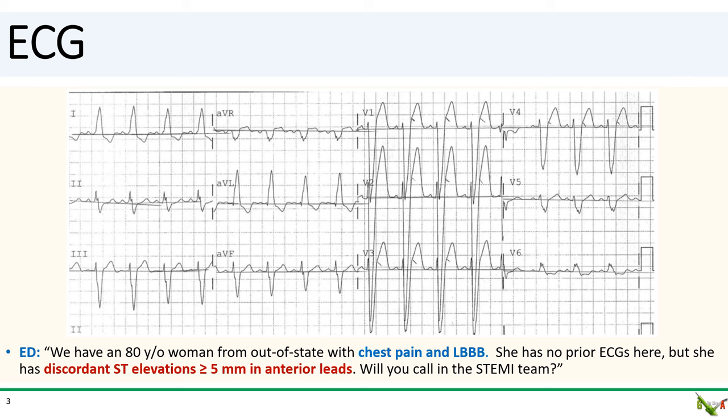The ED sends you her ECG. They tell you that she's an 80-year-old lady from out of state who presented with chest pain and a left bundle branch block. She has no prior ECGs in our system, but her current ECG shows discordant ST elevations more than five millimeters in the anterior leads.